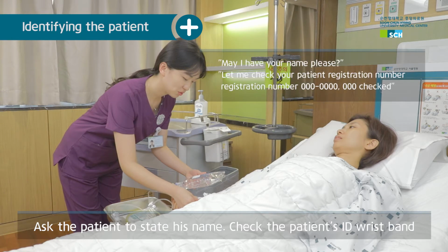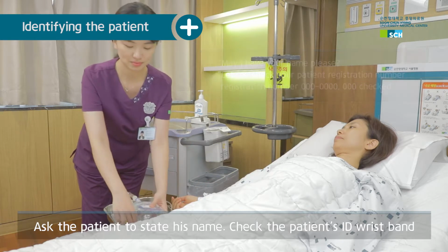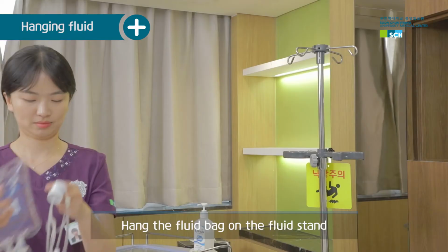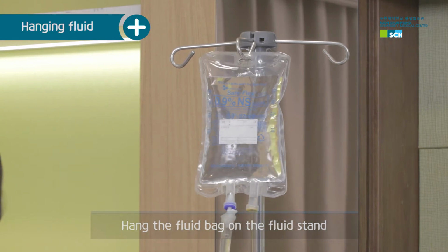Check the patient registration number and name by comparing the patient's ID wristband with the label on the fluid to be administered. Explain the purpose of the injection, the effect of the medication, and precautions to the patient. Hang the fluid bag on the fluid stand next to the bed and place the end of the IV set near the anticipated injection site.